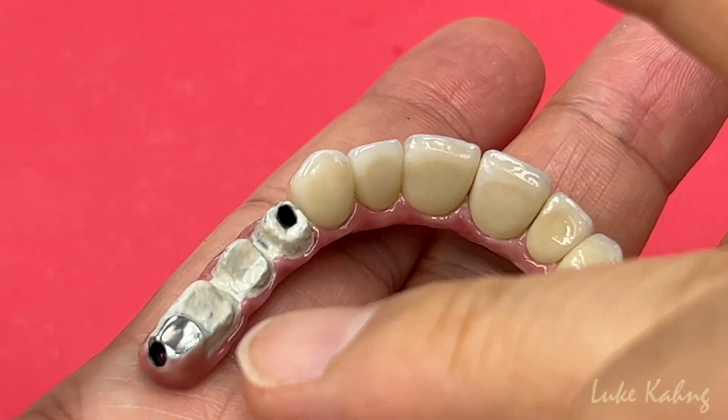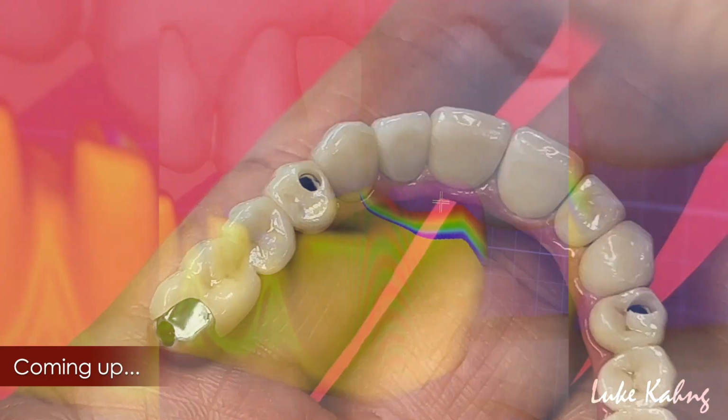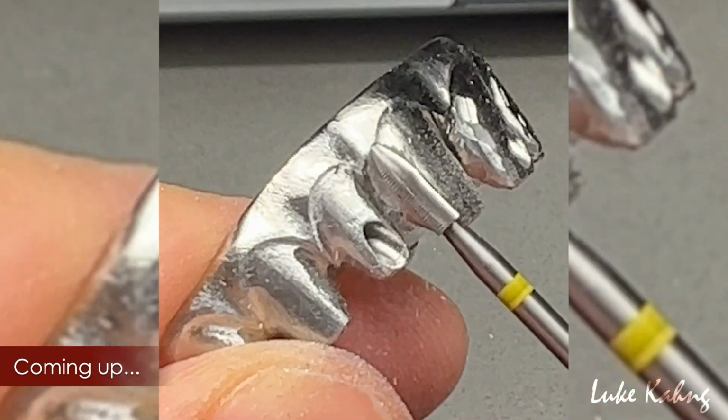So remember, there's lack of room here, so we make the metal island. Just cut away from the pack. 3-unit bridge, and the other one's 3-unit bridge too. They're all individual single restorations.